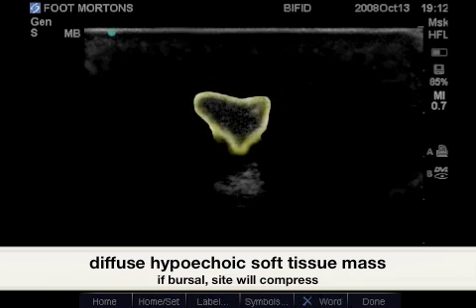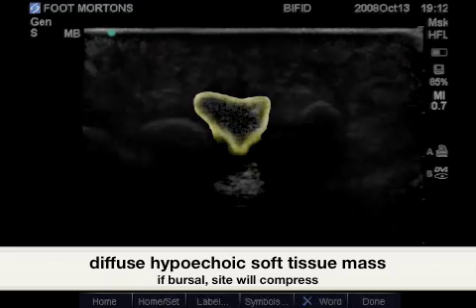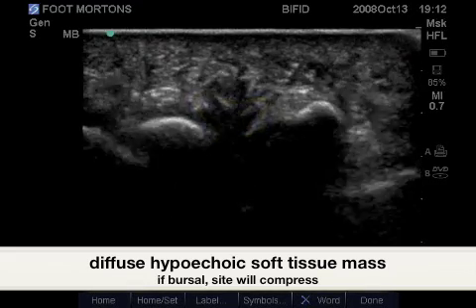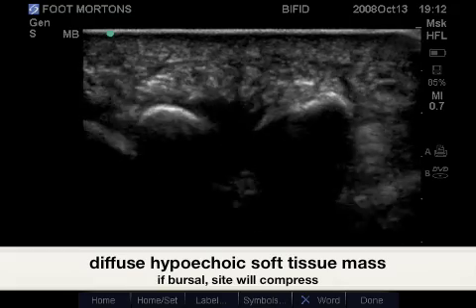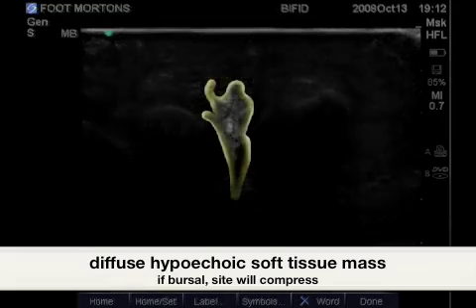Here we have another example of a Morton's neuroma, highlighted here in yellow, which is also further brought out by a positive Mulder's sign, or Mulder's test.